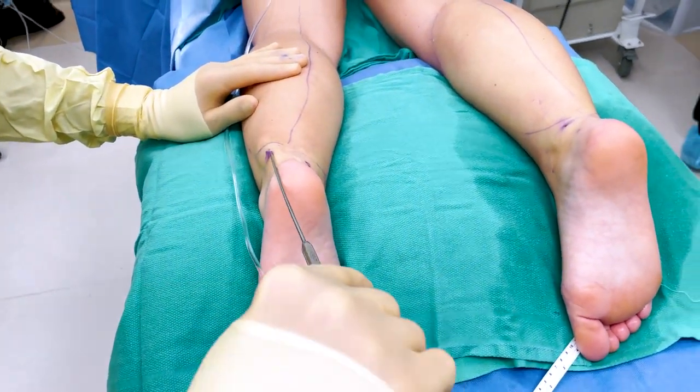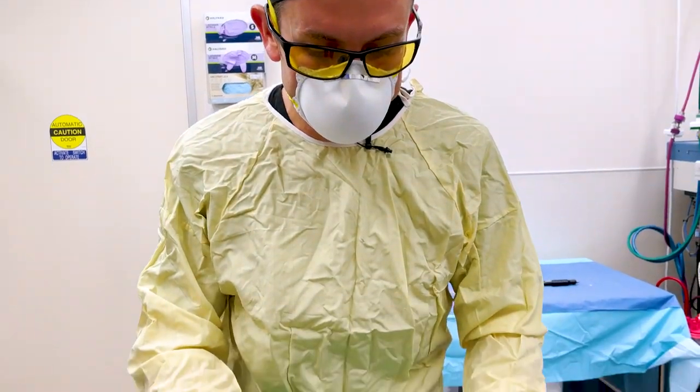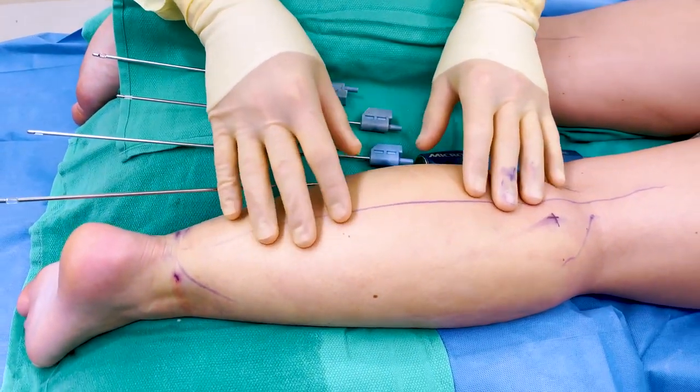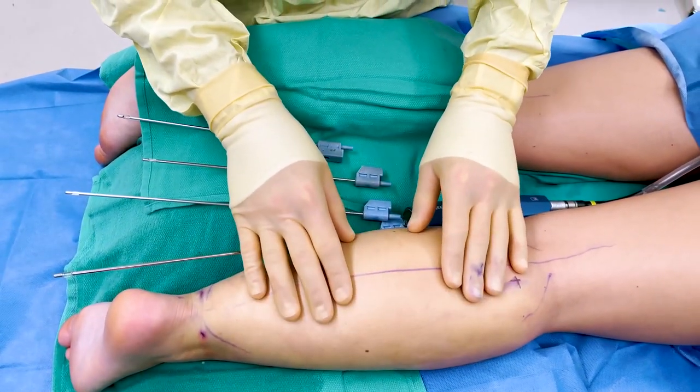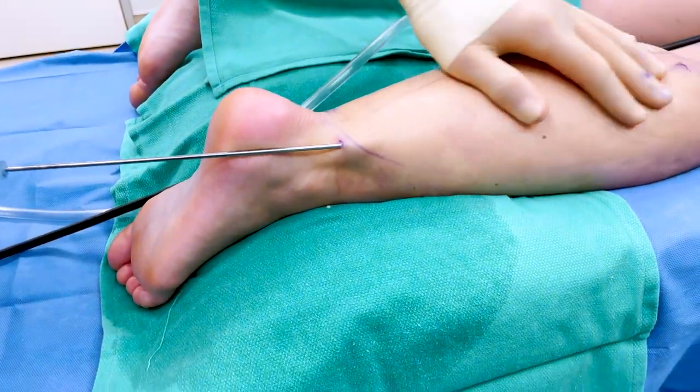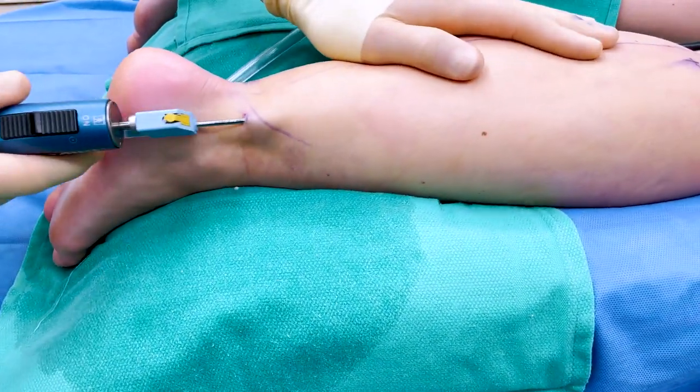The solution is taking effect. How we know is if the calf starts to get pale — that shows that the area is no longer getting as much blood flow, which we want, because we don't want bleeding. So we're breaking up the fat in the calf. This is going to liquefy the fat so it removes very carefully.